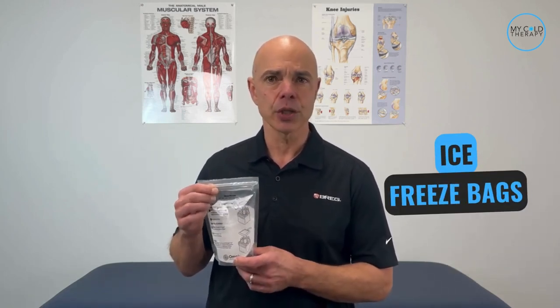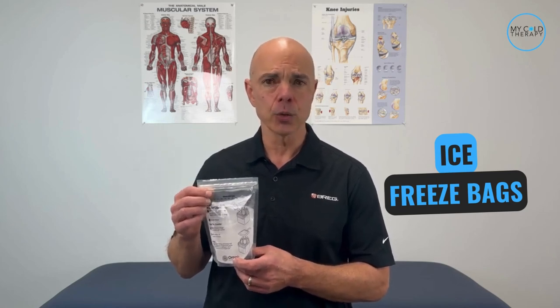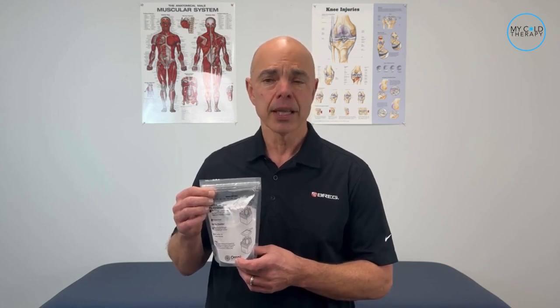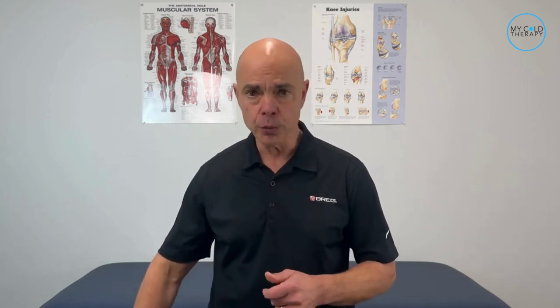Great job Michelle in showing us how to do that. As I mentioned earlier in the video, I'm going to show you our number one trick to help make things easier. We have freeze bags that you can use in the cooler and they come in packs of 12. You place three in the cooler and the rest in the fridge, then just keep rotating the bags. This way, especially if you're alone, you don't have to keep chasing after ice.